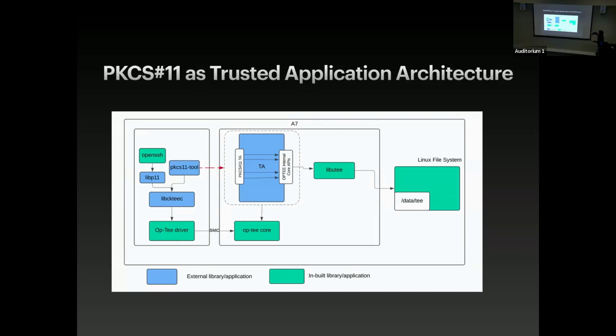So then it redirects the call to the secure storage. In this case, this device uses the Linux file system as a secure storage. But this is not a security issue because even though it's stored in the common file system, it stays encrypted and it also has integrity protection. So it's a well-known implementation supported by GlobalPlatform. Trust me when I say this, most devices don't even have this kind of TEE or secure architecture. I'm talking about the top 10% sophisticated devices, yet it's vulnerable.